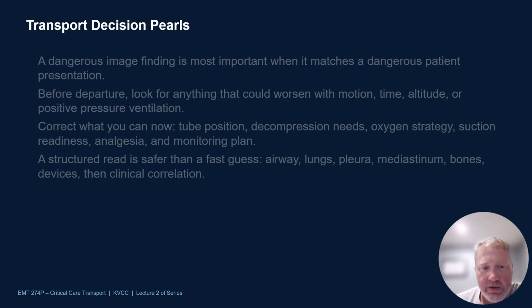Before you leave, while you're at the hospital or wherever it is that you're stationary and have access to a chest X-ray, look for anything that might get worse during the transport, whether it's the shaking around, the length of time that the transport's going to be, if it's a flight transport, take into consideration altitude issues, and also positive pressure ventilation for sure.